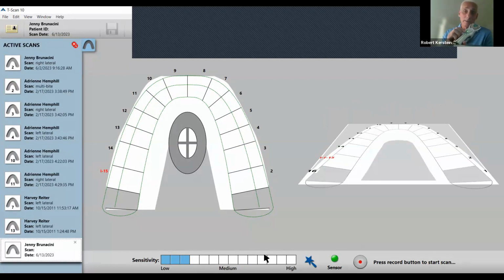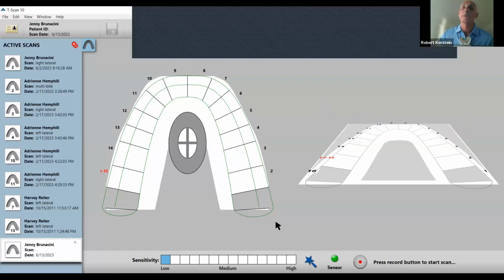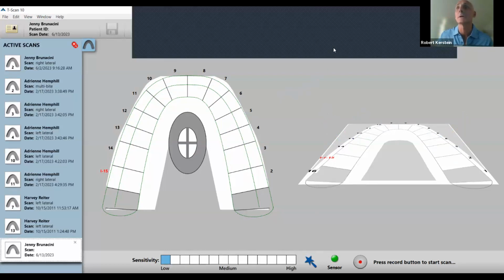So here I'm going to bite with this much lower sensitivity. And you see I gave 5 pinks. So I could actually come down maybe to the bottom one. And this is what you actually do. You calibrate the patient before you start recording. So with one pink, with one block of electricity in the sensor, that's ideal sensitivity. Okay, go back to the PowerPoint. Stop this share.